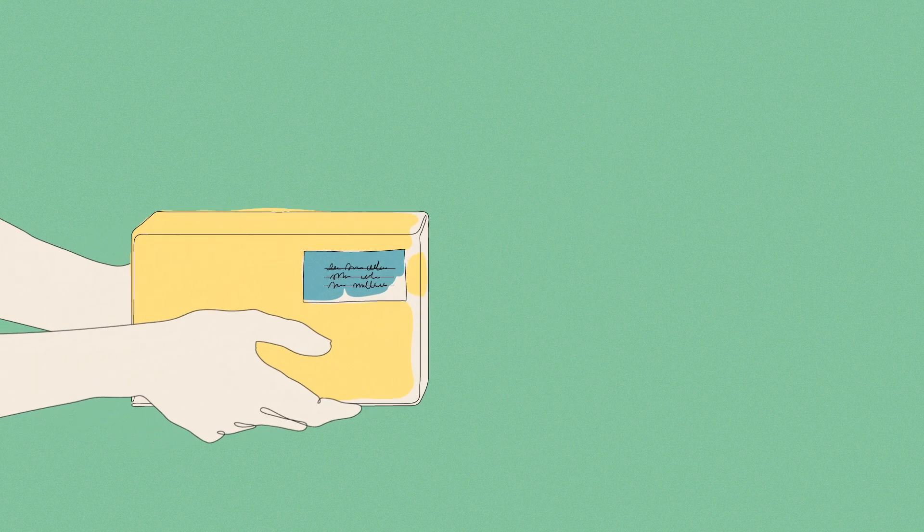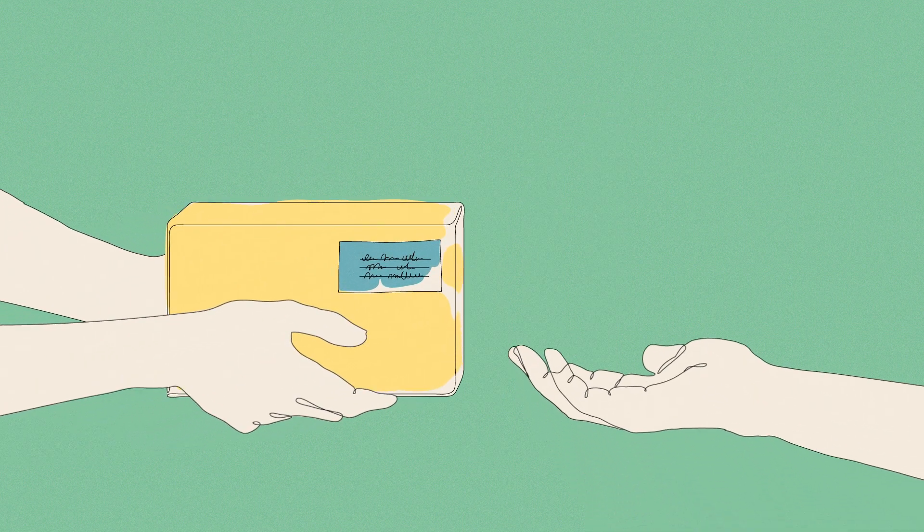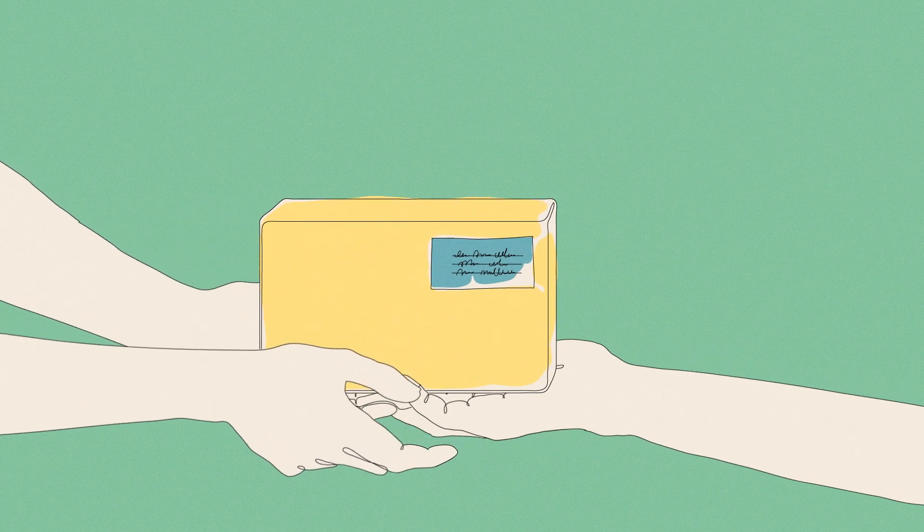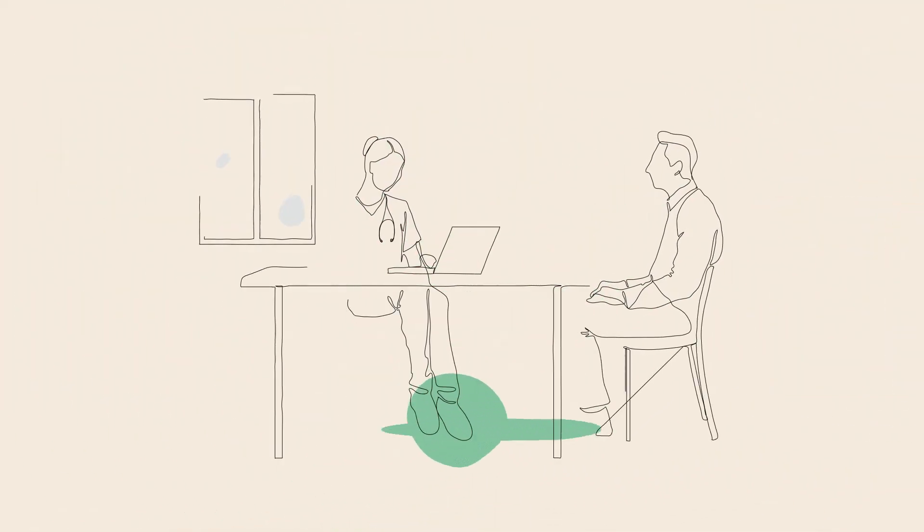There's less administration too, as lancets, test strips and needles for Actiste are automatically resupplied directly to the customer's home.